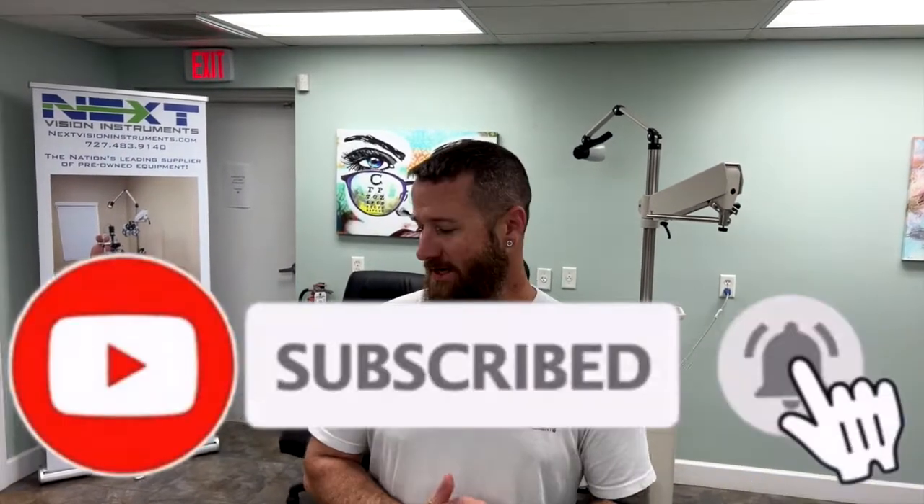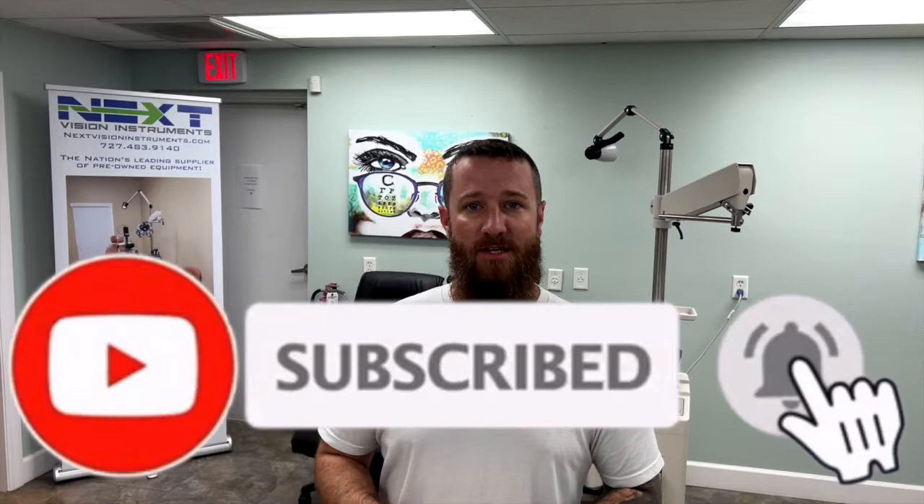Hi, I'm Chad with NextVision. We're going to be going over the initial setup and operator training for an OptiView iView, the OptiView iCam, as well as the Combo — which is both of them, the iView and the iCam — known as the iFusion. We're going to go over everything here.